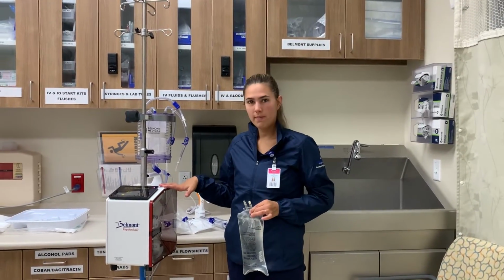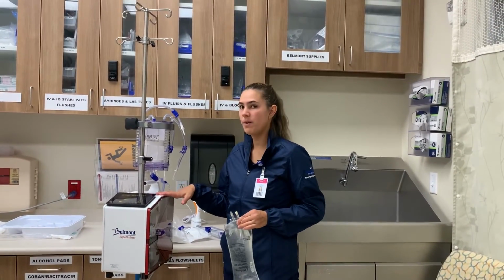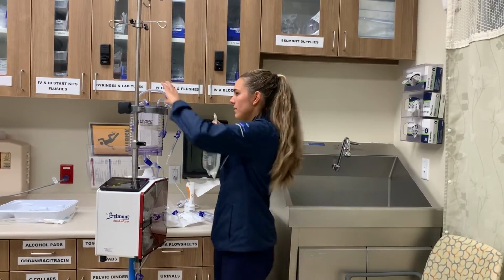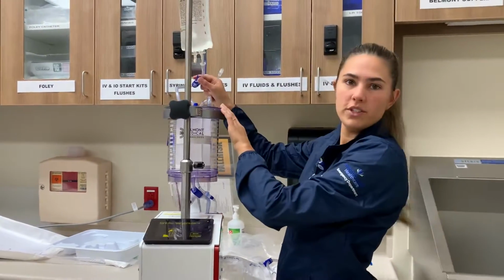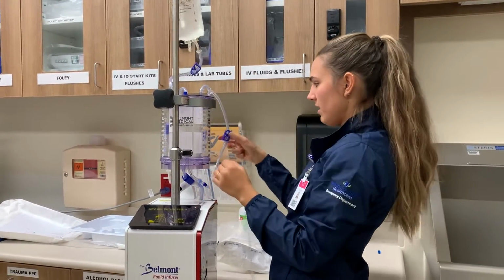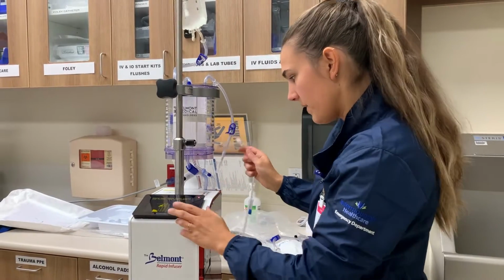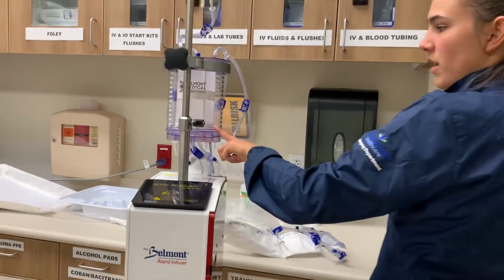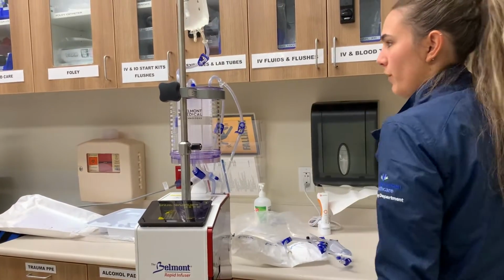Okay, the device is beeping at us because it wants us to reprime the tubing. So I'm going to connect the fluids. Now the fluids are connected. I'm going to unclamp the tubing and I'm going to select reprime. So now you can see the chamber is starting to fill up with the fluids.